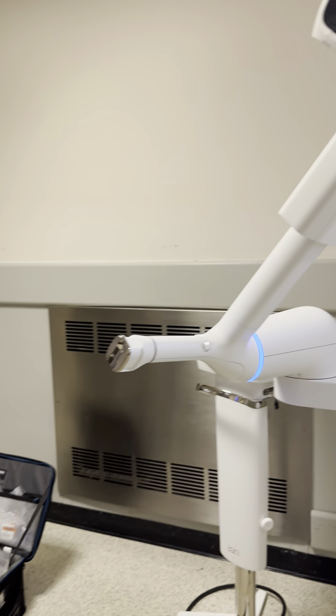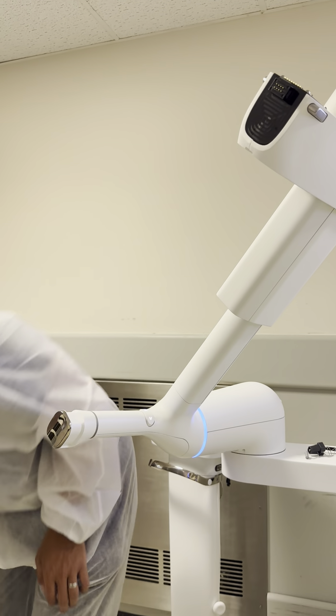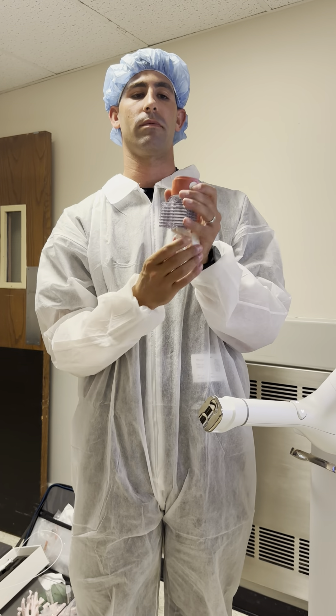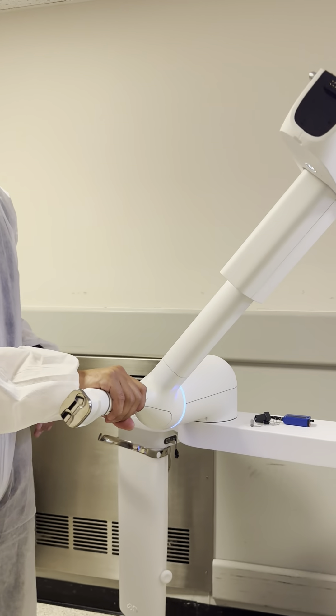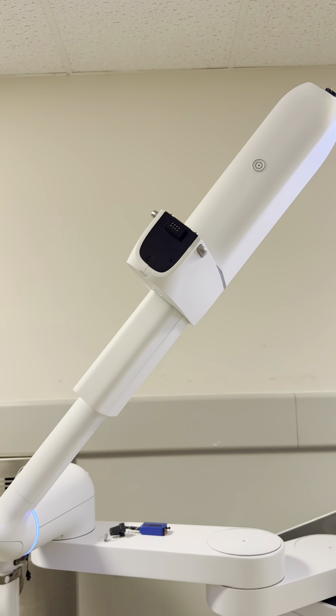Now we're going to clean the entire robot with Purple Wipes. The vision probe is cleaned with Purple Wipes. This is the central sterilized, so you can clean it — you can just spray some pre-clean spray on it. The robot can be cleaned with Purple Wipes, including the screen. You're going to want to avoid these gold pins on the top and bottom, and these black areas. You can really just clean everything that's white.